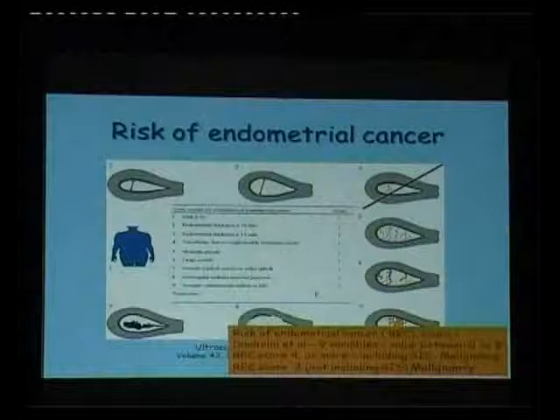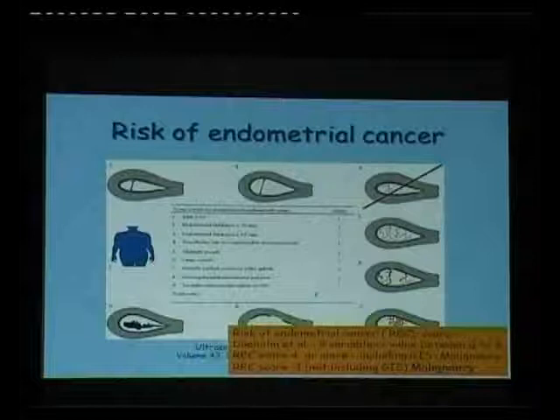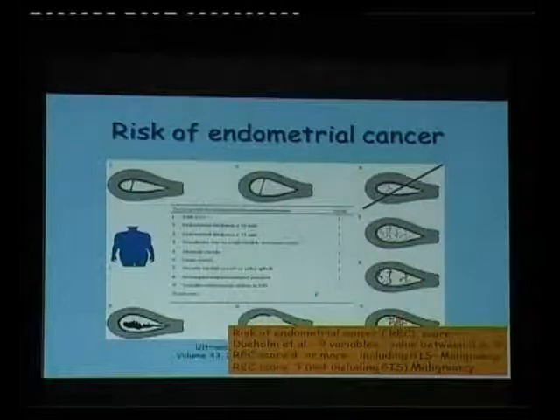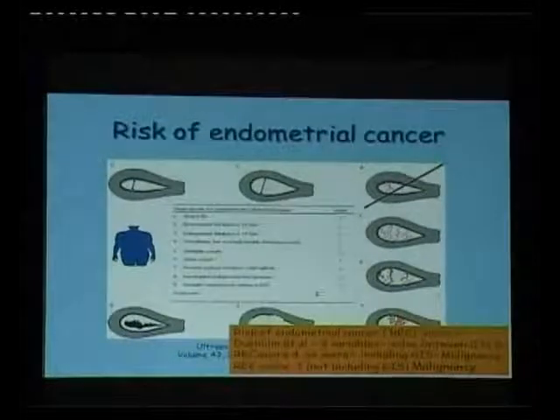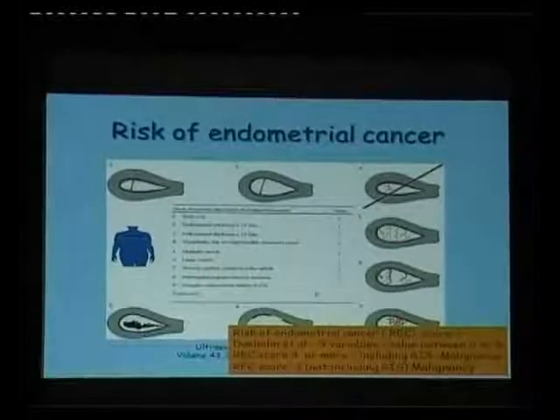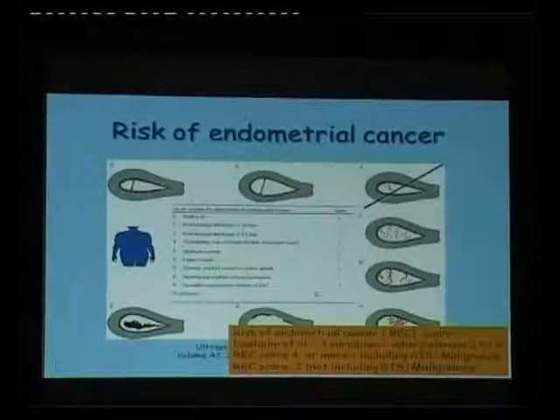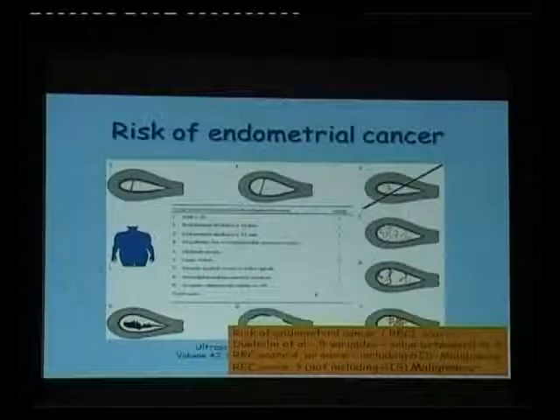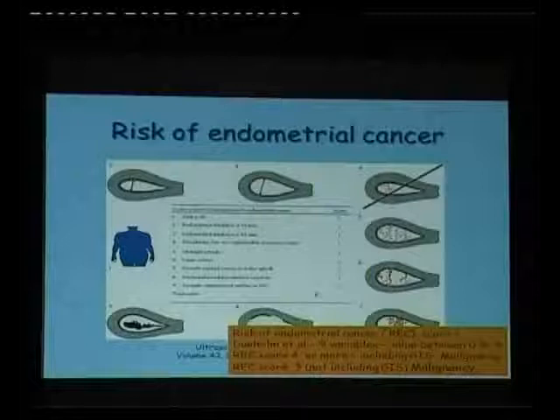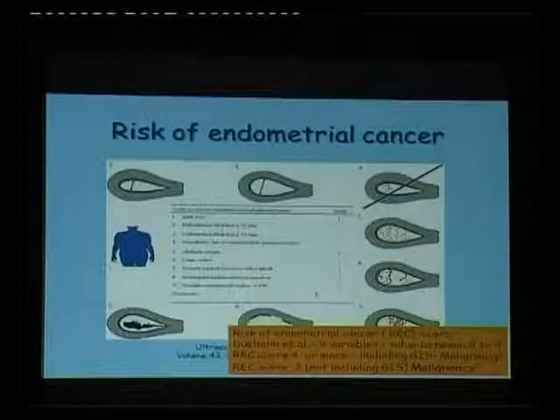Now, Dueholm et al. have suggested a risk of endometrial carcinoma assessment, where they have taken 9 parameters into consideration. One is obesity, that is, taking BMI into consideration. Each point is scored as 1: endometrial thickness above 10 millimeters, endometrial thickness more than 15 millimeters, presence of vascularity, presence of multiple vessels, presence of intense vascularity, interruption of the endomyometrial interface on saline infusion sonography, and irregularity of the outline.